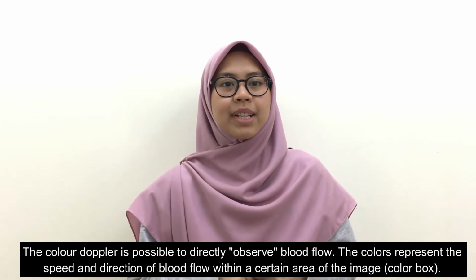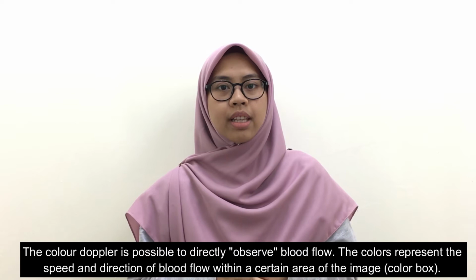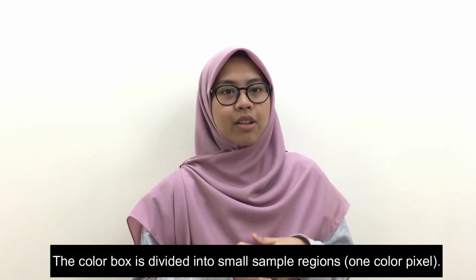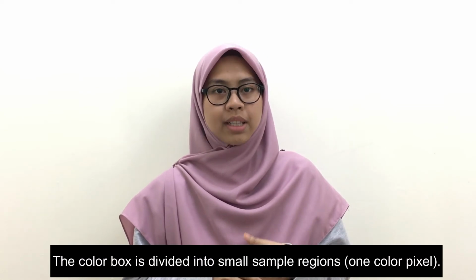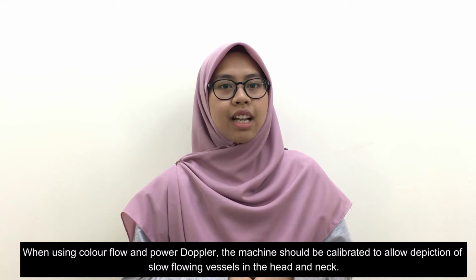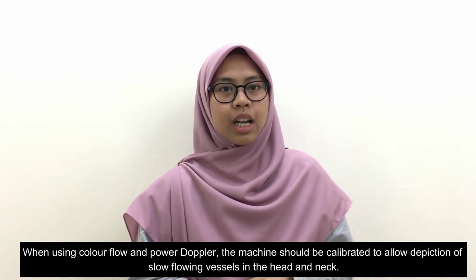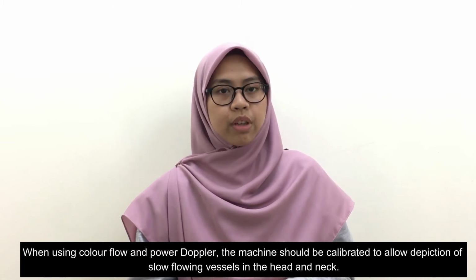The colors represent the speeds and directions of blood flow within a certain area of the image, which is the color box. The color box is divided into small sample regions, each of which is 1 color pixel. When using color flow and power Doppler, the machine should be calibrated to allow depiction of slow-flowing vessels in the head and neck.